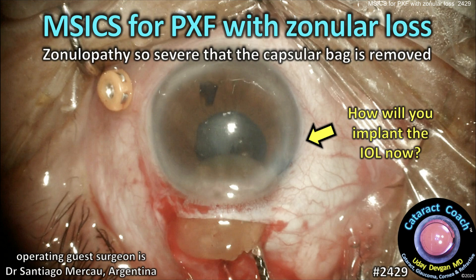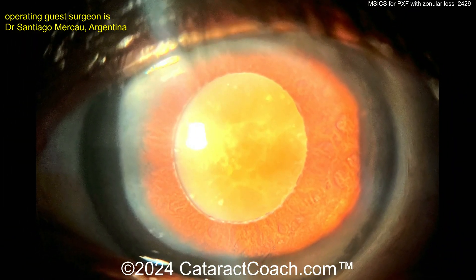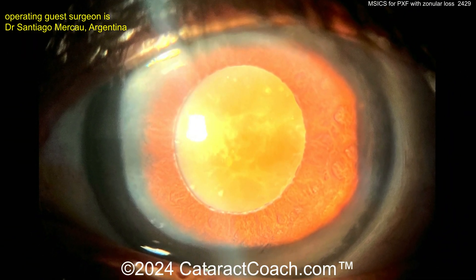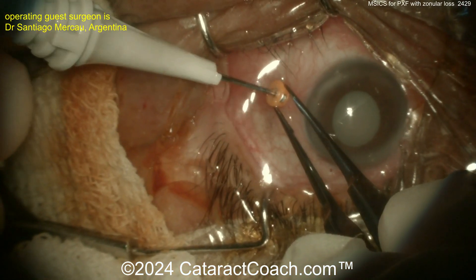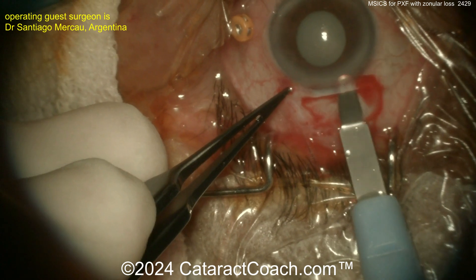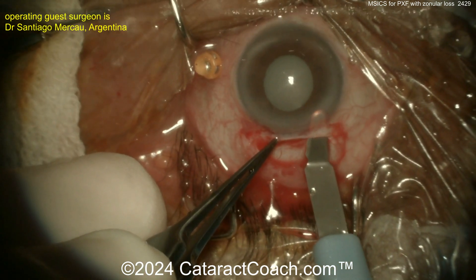cataractcoach.com: MSICS for pseudoexfoliation with zonular loss — zonulopathy so severe the capsular bag is removed. Here's the pre-op picture. Look at the pupil margin, all that white pseudoexfoliation material, and how the lens is right up against the backside of the iris. That's a bad sign. The surgeon already places the pars plana port in preparation.